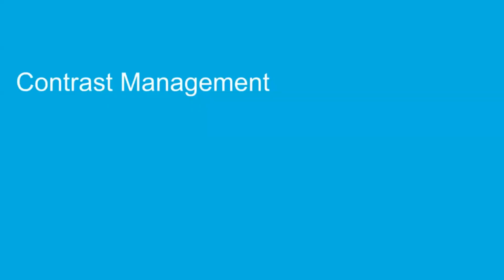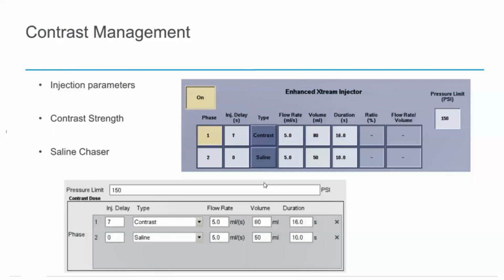What about contrast management? What do you have to understand here? Let's have a look at contrast management now. The administration of contrast media is a vital part of CTA. We need to consider the injection parameters used, the strength of the contrast, and if we are going to use a saline flush or chaser.